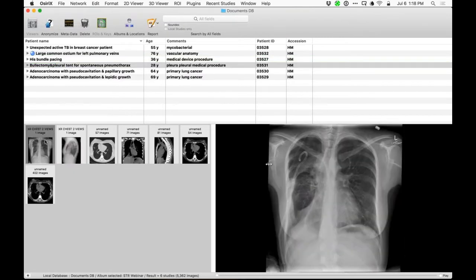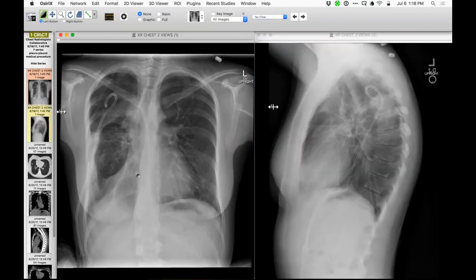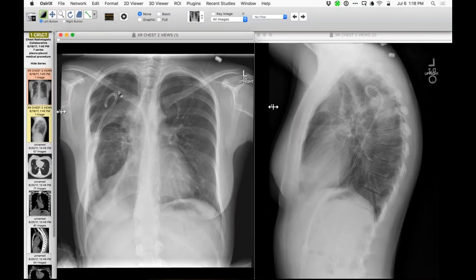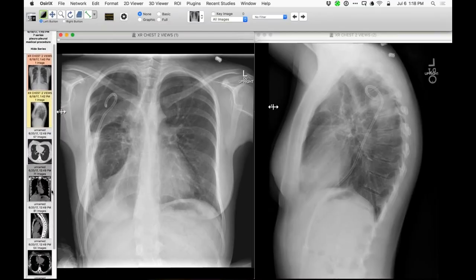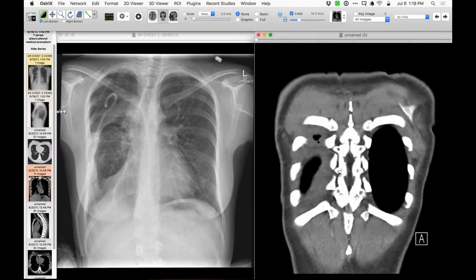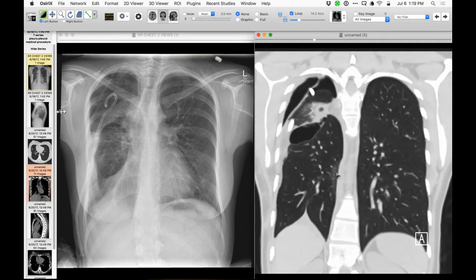This is a nice case of trying to understand on chest radiography what you're seeing. Looking at a combination of the PA and lateral, we can see there's a pleural space issue - some pleural fluid, pleural air, some residual extra-pleural air up there, and a chest tube. There are also some other findings that need explaining. On the frontal projection, we can see the pleural line - that's fine - but then this opacity which is really quite odd, and some residual pleural fluid.